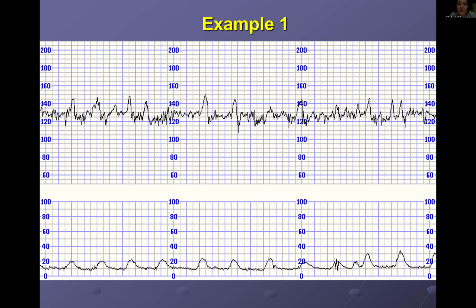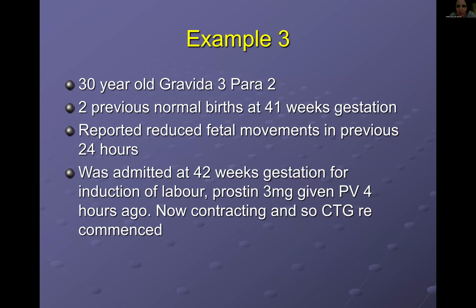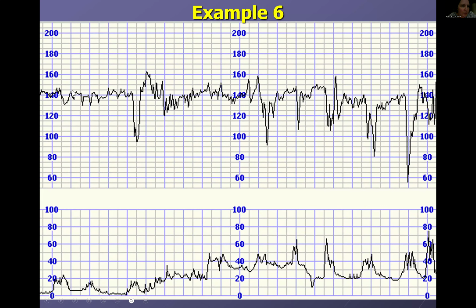What would be important is if the baseline is falling, so as the CTG is progressing, the baseline is falling. And in fact, there was one, let me find it, where the baseline was falling, and here it is. In this case, here it started off as being 140, and there are times when this baseline is about 130. In that case, I would comment that at, let's say, 10 a.m., the baseline was 140, and at 10:20, the baseline was at times going down and below.